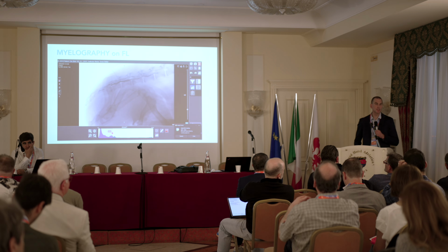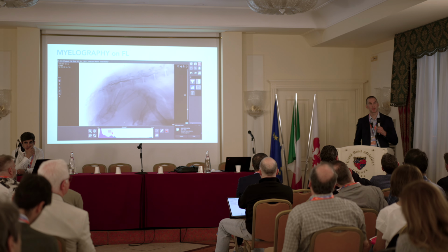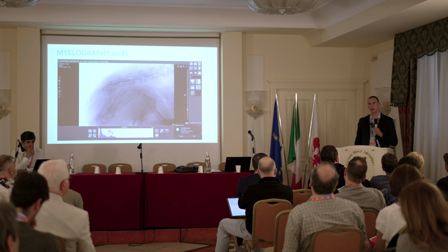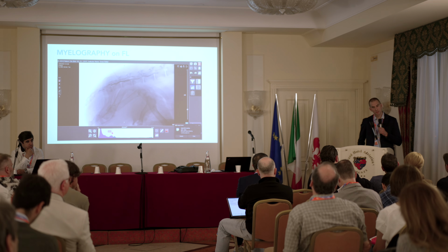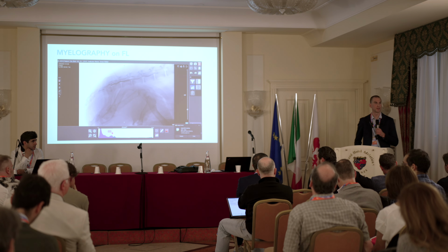Yeah, sometimes it's not easy, but I think in those cases, the cranial tap is easier than caudal. Their channels are quite narrow, and sometimes it's not on the first tap to go in.